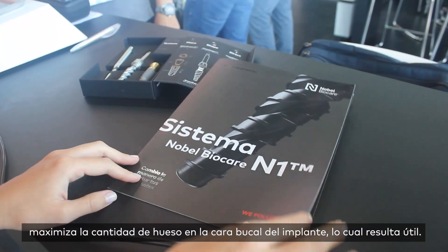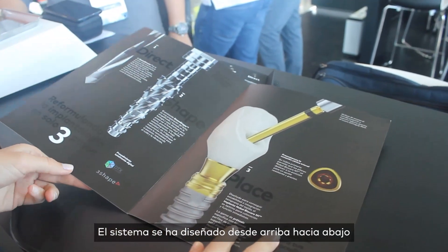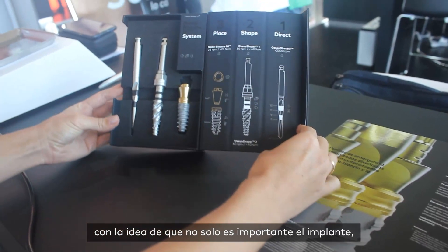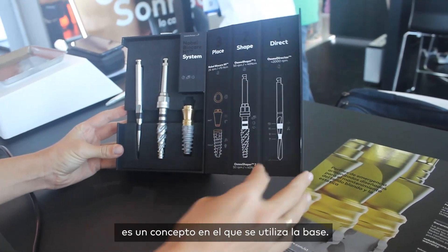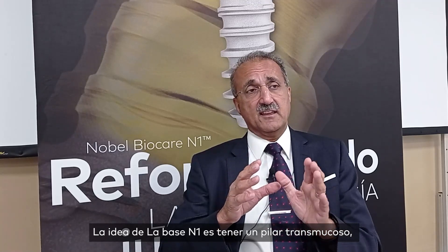The system has been designed from the top down — it's not just the implant, it's a concept. The N1 base has the idea of having a transmucosal abutment which you place at the time of surgery, or you can use a multi-unit if you're using multiple implants.